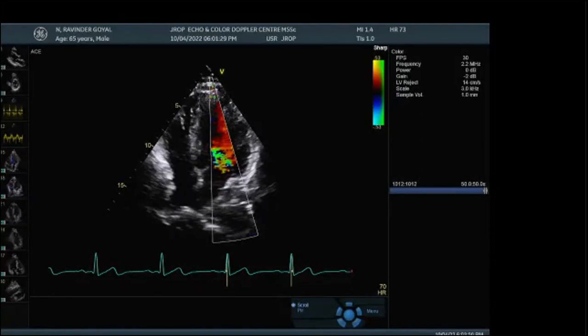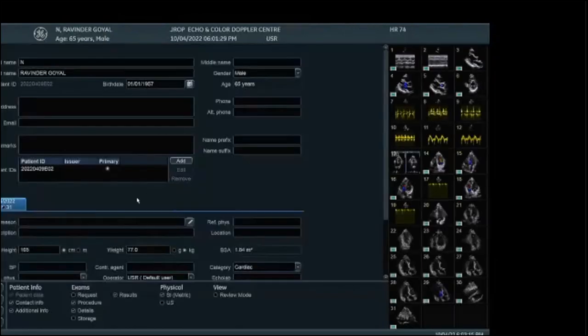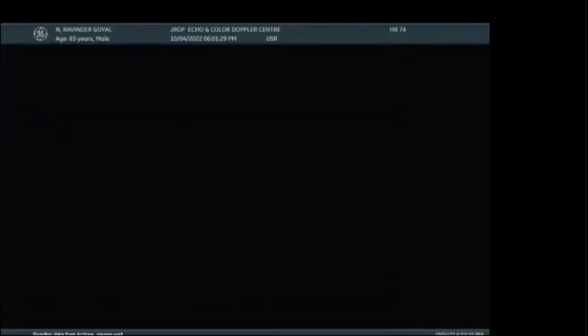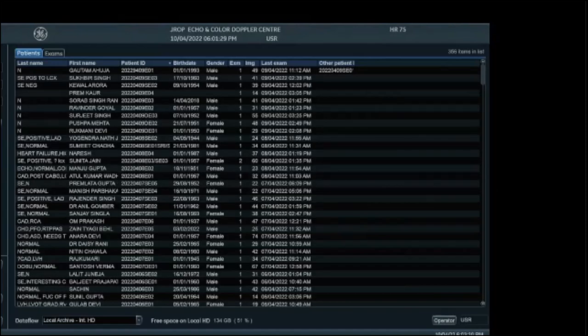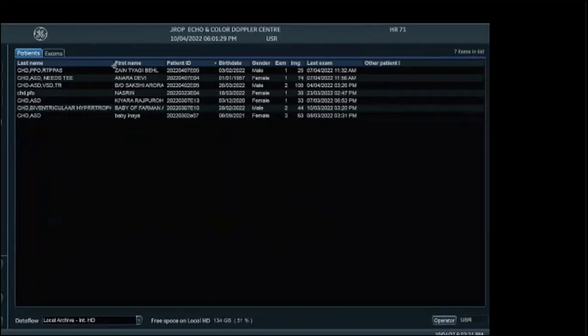Sir, my question is, if a patient has ASD or VSD, in atrioventricular flow we know that the flow is from atria to ventricle, which is the major flow, and we can map the regurgitations. But in a patient with ASD or VSD, it will be tough if it is flowing from left to right or after reversal. No, it will be very, very clear. Let me just take out a slide from my armamentarium. The colors are very clearly seen.